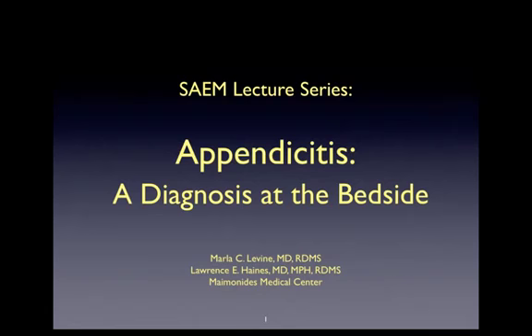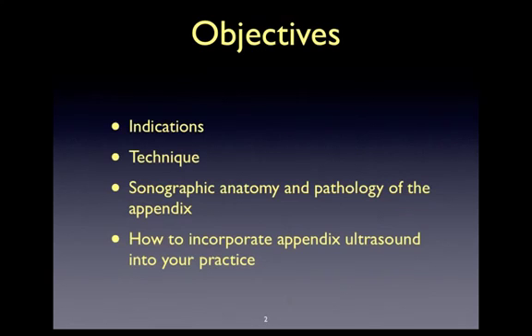This is Marla Levine, and today we will be discussing bedside ultrasound as an imaging modality for the diagnosis of appendicitis. The objectives of this talk are to describe the indications and technique to performing the appendix ultrasound. This will be followed by a review of the sonographic anatomy and pathology of the appendix, and then we'll discuss how to incorporate the appendix ultrasound into your practice.